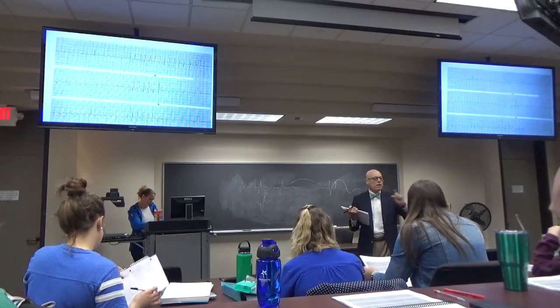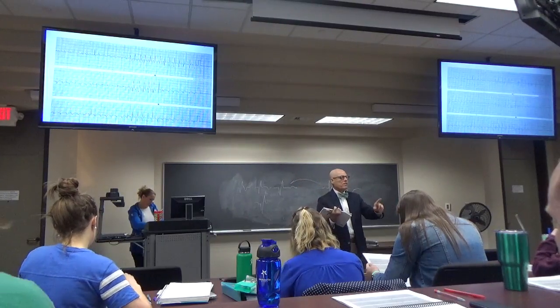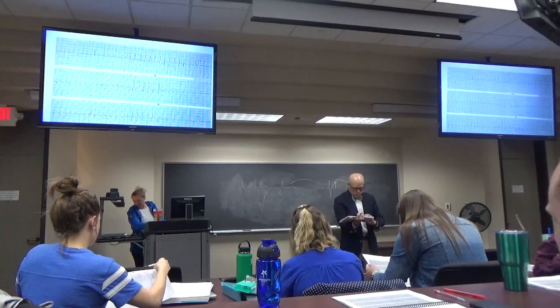AV block and rhythm are not the same thing. Is there a P wave before each QRS, and is the P wave causing the QRS? Yes. Then it's a sinus rhythm. Okay. So a sinus rhythm, heart rate.